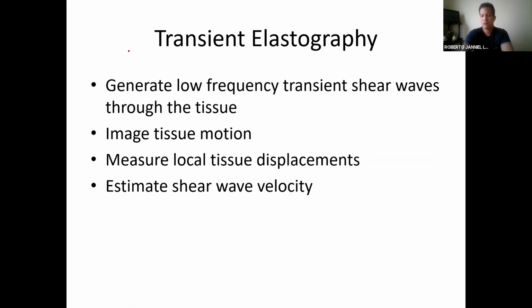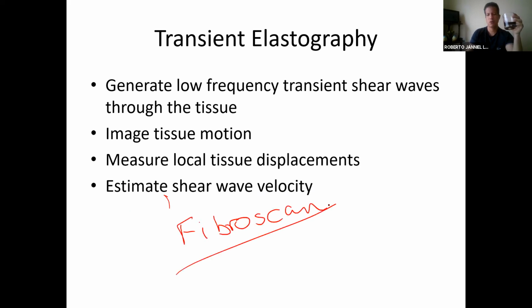You have transient elastography. Its most successful implementation would have to be the technology called FibroScan. You can look it up, you can Google it.